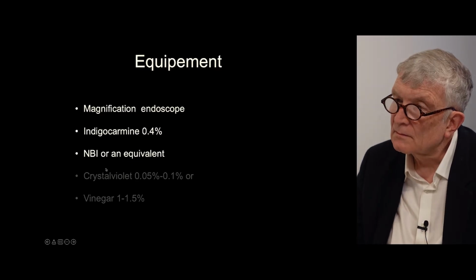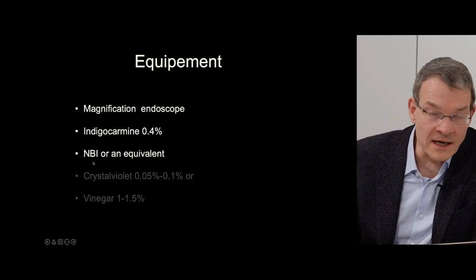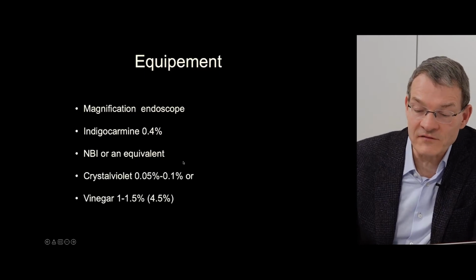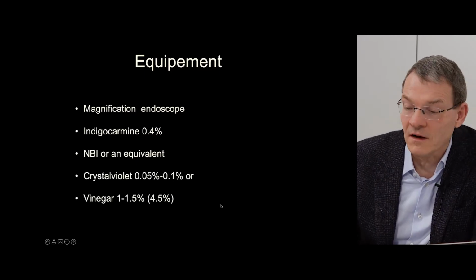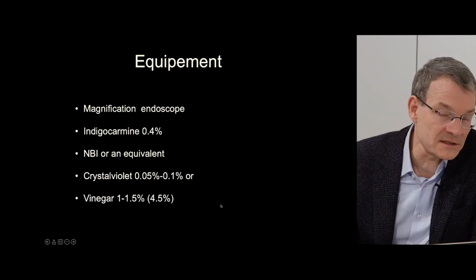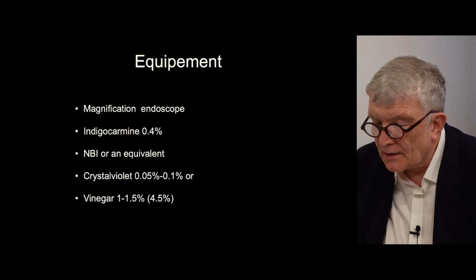And then, first of all, you should use NBI or an equivalent from other companies. And then you should have crystal violet or vinegar available. So mostly acetic acid? Acetic acid, yes, for practical reasons. Exactly. Okay, so I would like to show you a case.